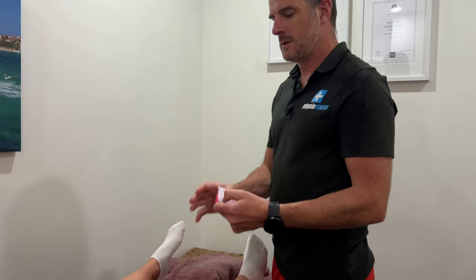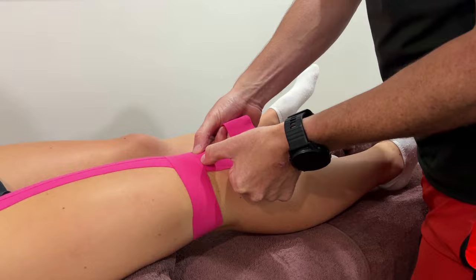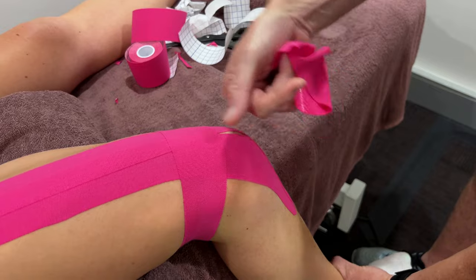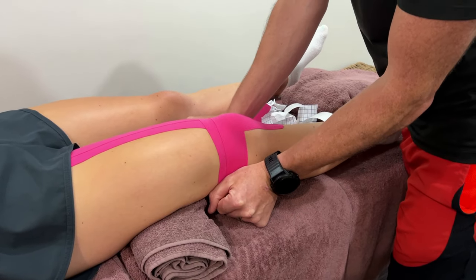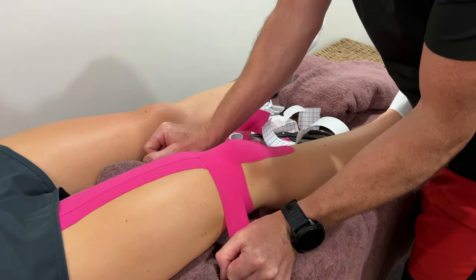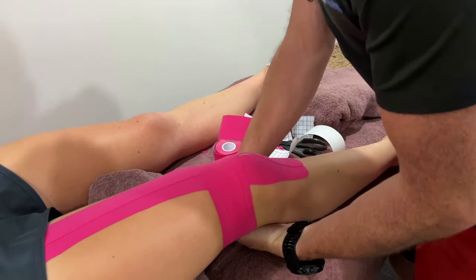For your second cross tape, if you're going to do two, don't go directly over top — give it a bit more offset, either higher or lower than where you put the first one. If you've overshot or feel you've gone too low, you can adjust this one and go higher or lower accordingly. So we're going to go a little bit higher — same drill, pull it down, anchor both ends at zero, and get it nice and flat through there. That's really helpful — so when they bend their knee and load it, they're going to feel that pressure which gives them support. That's what you do for a quadriceps tendinopathy.